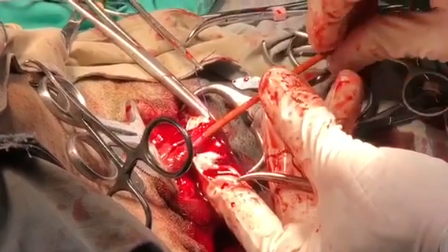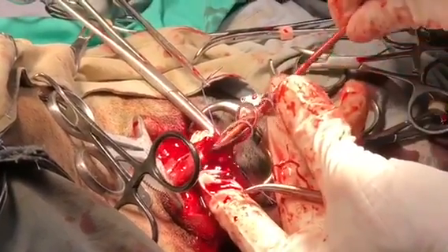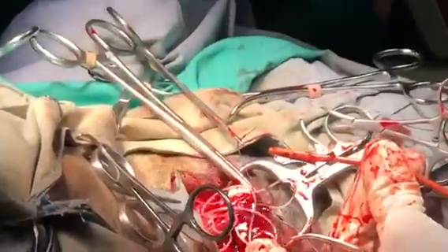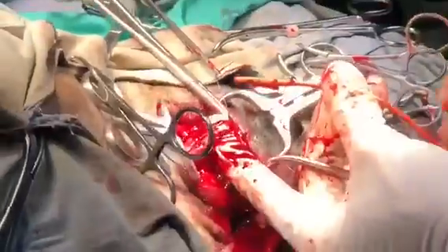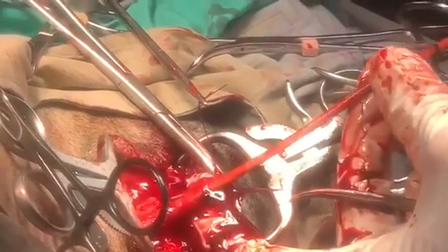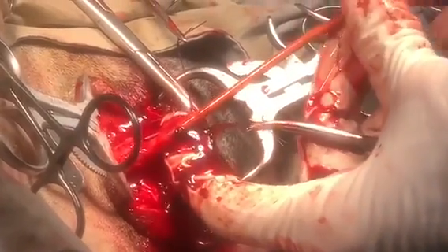Alright, so we're twisting, and as we twist back we pull — and we have heartworms. They were in the heart, so hopefully we pulled some more out of the heart into the cava. As we twist — think pasta, bowl, and noodles — everything comes together, that's the whole plan here.